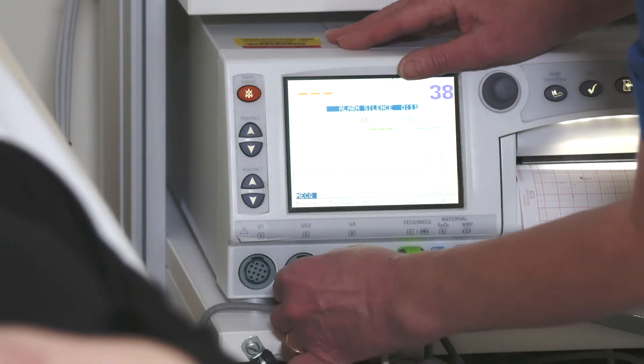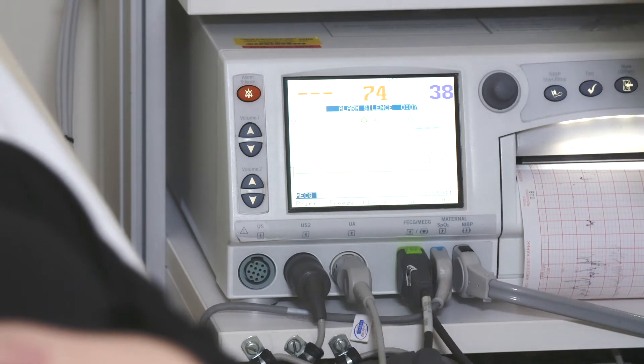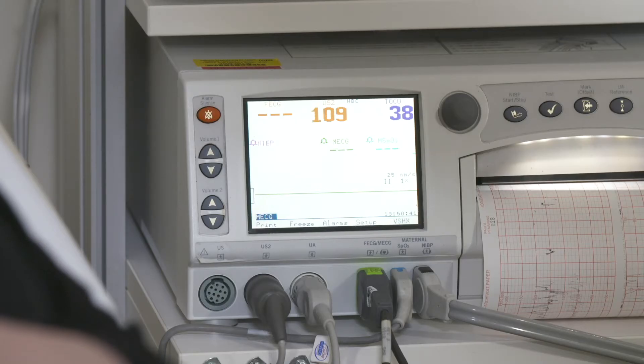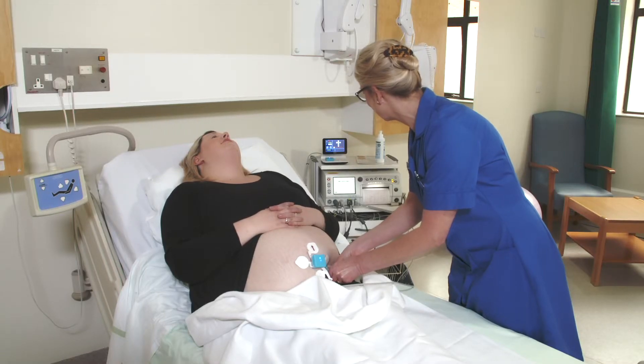One of the main advantages of the Novi system is that you can plug an ultrasound transducer into the US2 or US1 port of the Koro 259CX and fill short gaps, especially those that can occur towards the end of stage 2 when the mom is pushing. Novi is vulnerable to gaps during pushing in stage 2.